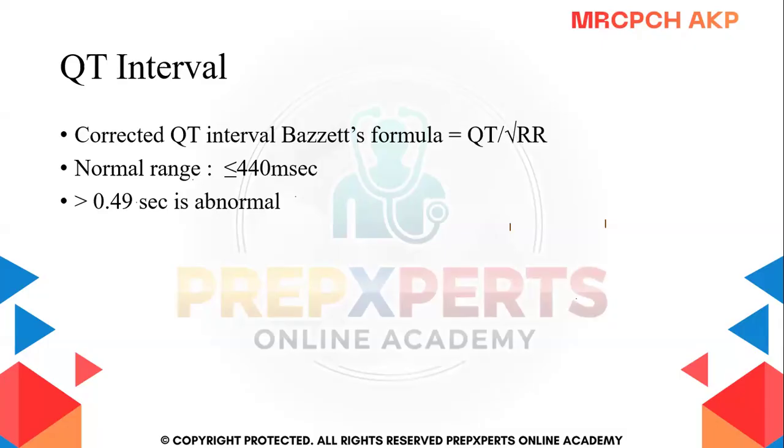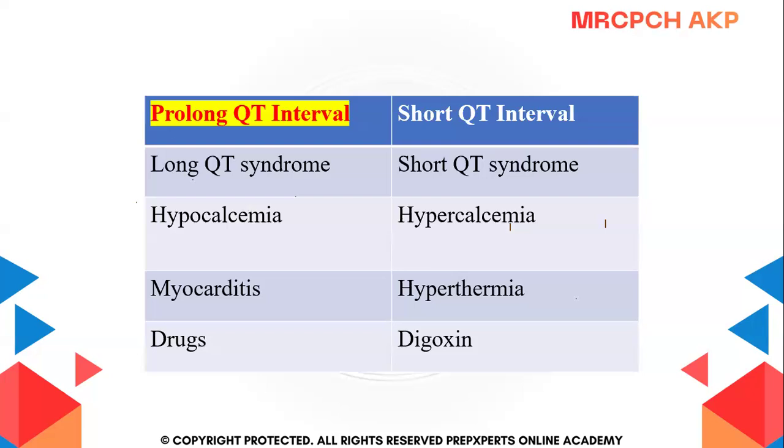Okay. Just for your information, ECG guideline interpretation is given in the pediatric guideline book. I think it's page number 131. Just go through that once after this presentation. I think I have covered everything, but just go through that so that you know if anything's different.